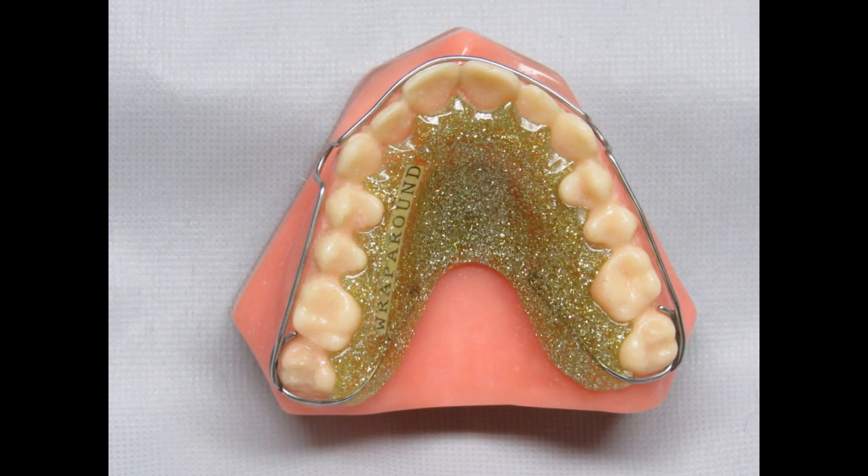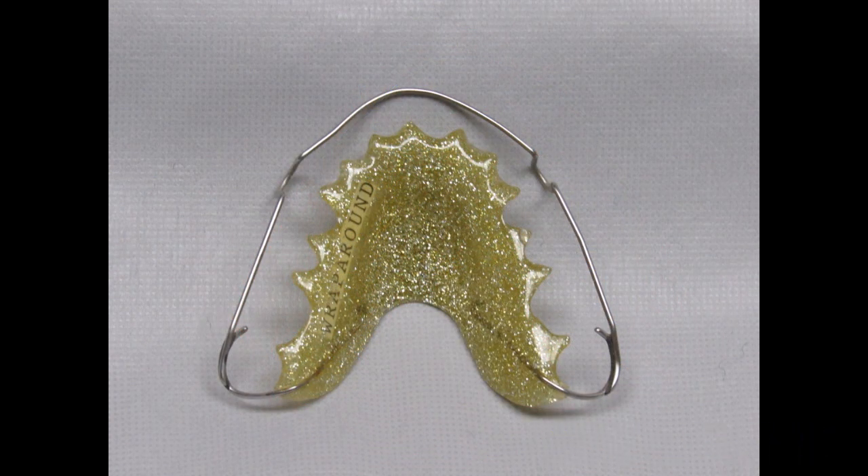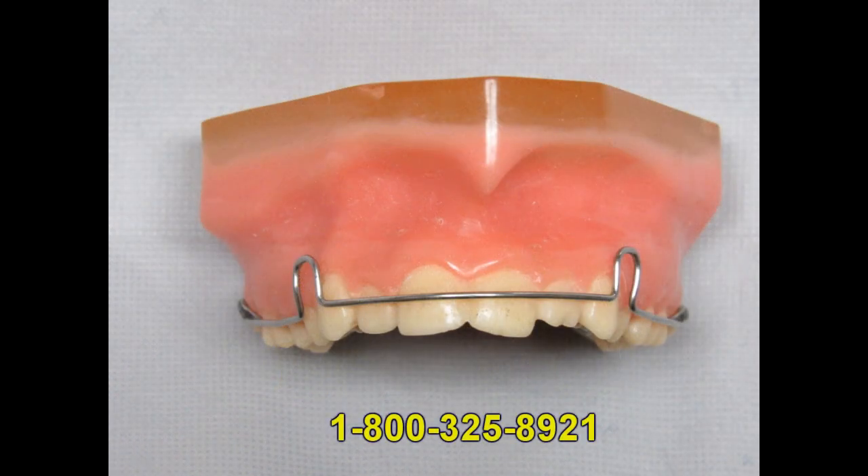A very popular design alternative is the wraparound Holley retainer. This design can be used for the upper or the lower arch. The wraparound design does not have any wires that go over the occlusion. Many doctors prefer this design over the standard Holley — there are no wires that the patient can bite on and the occlusion can settle in better over time. Retention is not as good with this design and there is not as much that can be adjusted if you need a tighter fit. A fully erupted second molar can improve the retention and fit of the appliance.